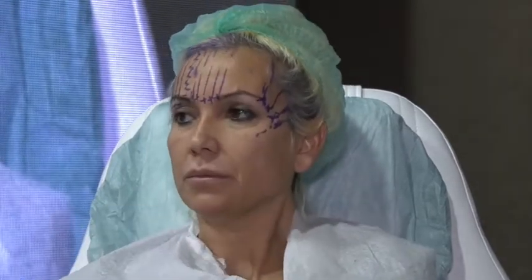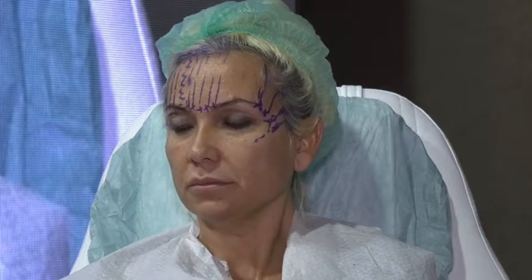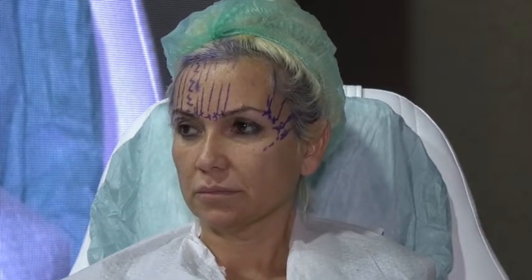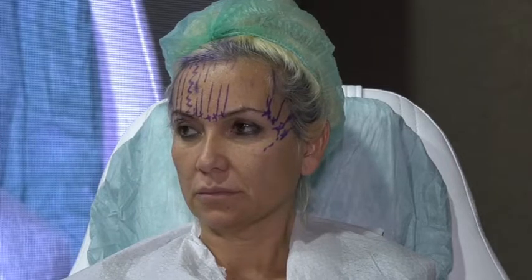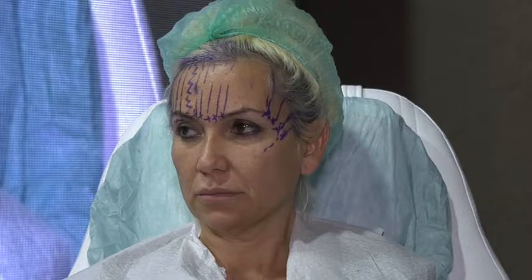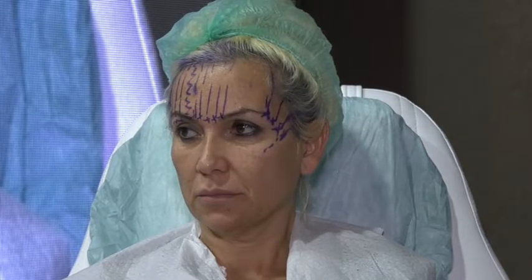Of course, when it is fixed with double thread like that, it's better to fix with that one. When you have fixation with an angle, it's better to have it. We do this sometimes to make what we call a virtual angle, so it's already coming in the thread. So it's much better when you insert that way as opposed to inserting that way.